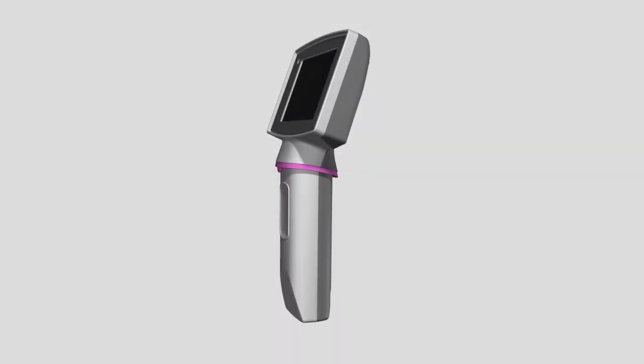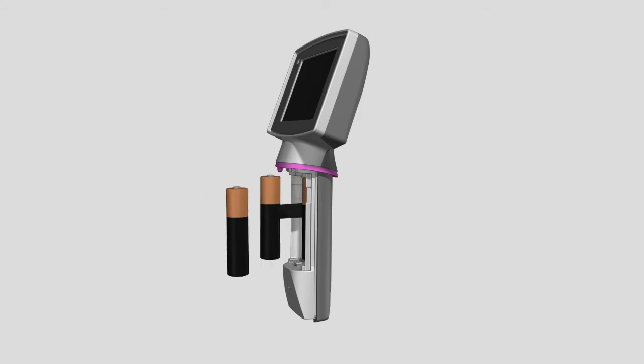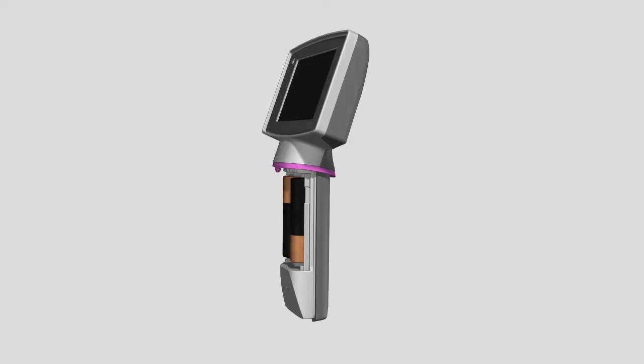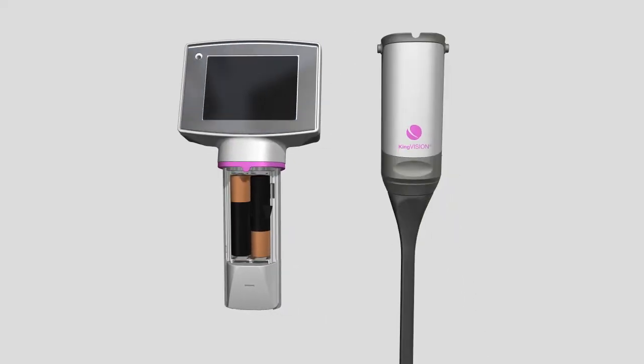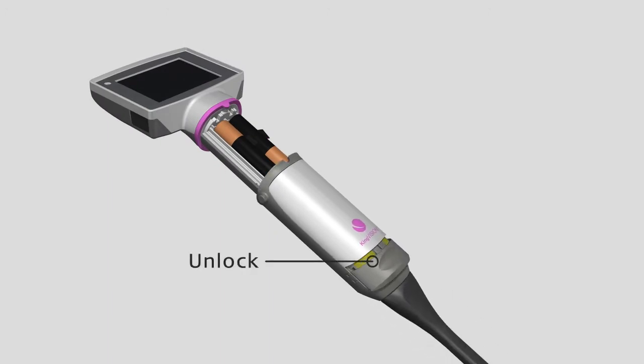The KingVision A-Blade is powered by 3 AAA alkaline batteries. To insert the batteries, remove the battery compartment cover and seat the batteries on top of the black pull ribbon, following the directional guide located in the battery well. Ensure that the lowest battery is properly seated. Next, unlock and attach the video adapter to the display.